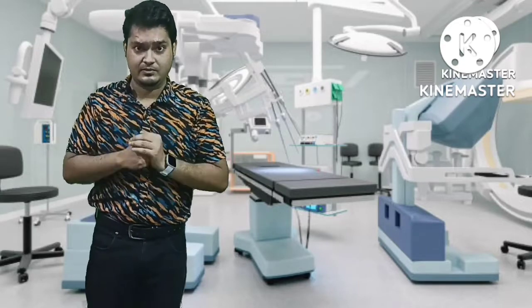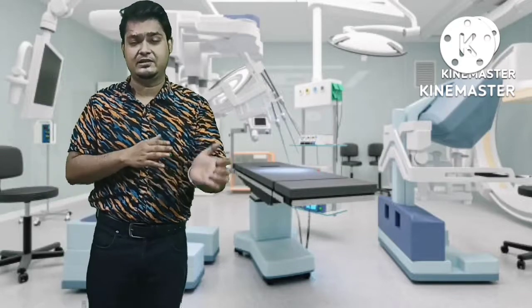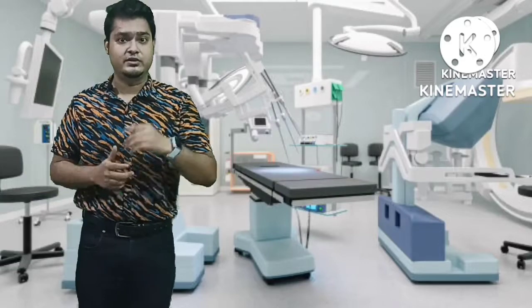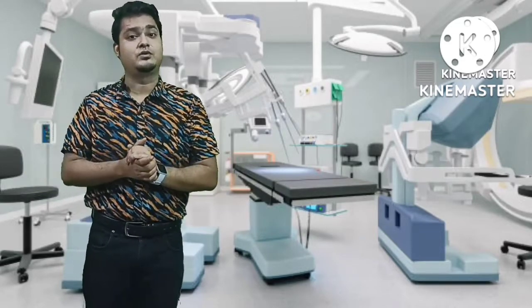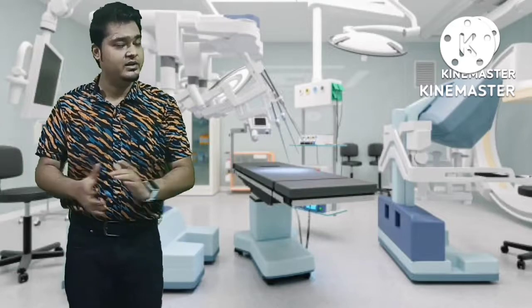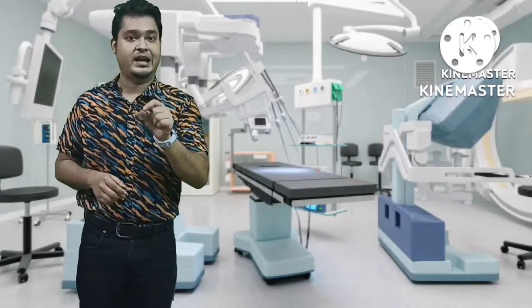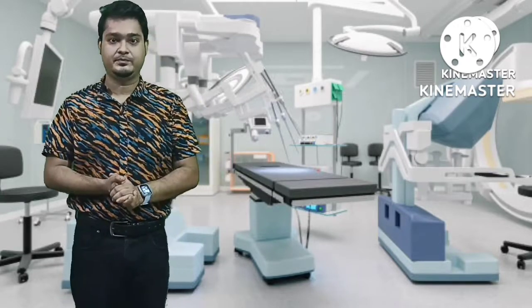So now we are going to discuss what the advantages and disadvantages are of the traditional catheter angiography, as well as the advantages and disadvantages of the CT coronary angiography. And we are also going to discuss the similarities. The similarity between these two is that both imaging techniques use radiation.